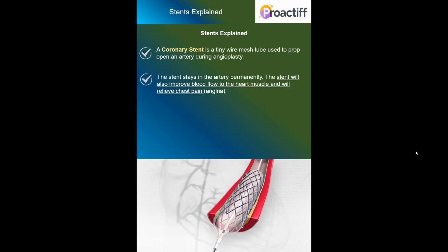As the arteries narrow, the stent is one of the techniques to be inserted into the artery so as to ensure the passage of the blood flow happens at a normal pace. And this is going to stay there forever.